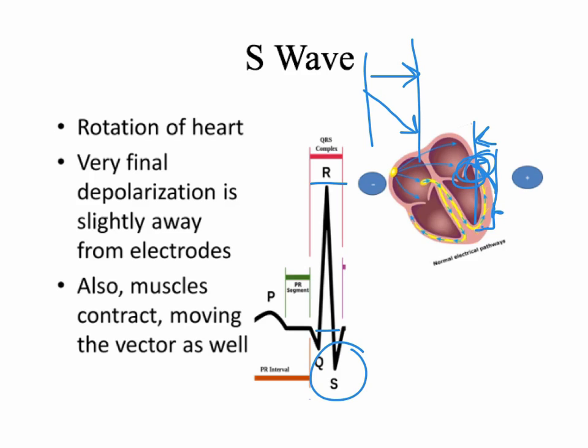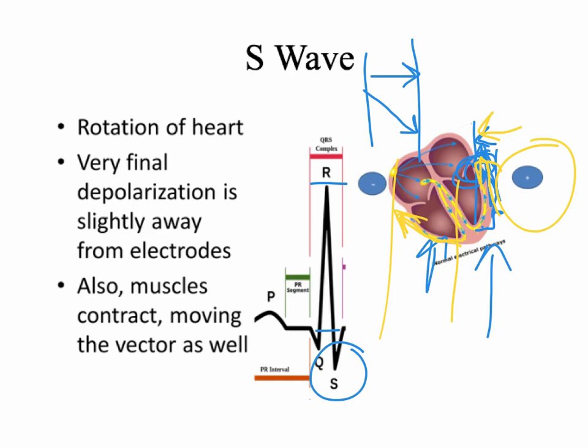Now the left heart is going to be your main producer of your QRS complex because it's much thicker than the right heart, and so like I said earlier, it's going to be location and muscle thickness that determine the direction and size of the EKG tracings. And you'll also see maybe it's mostly upward movement whenever you're over here, and I should change the color so you can see this. So it's mostly upward movement. It's a little bit rightward movement, but you can see that over here the right heart is moving almost completely to the right direction, and so you're moving away from that positive lead. And I should just mention as a refresher that I'm referring to this as the patient's left and the patient's right.